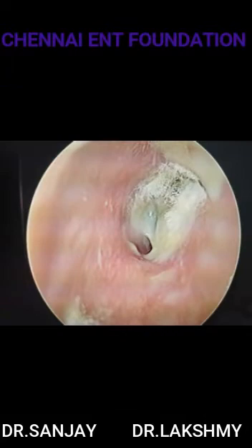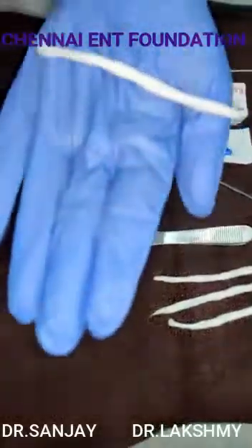or even plain trauma to the ear. This picture depicts a fungal infection of the ear. For this, we've cleaned the ear using suction clearance, following which we keep a medicated wick.